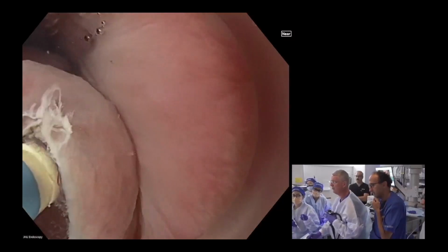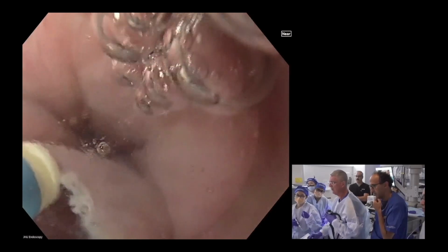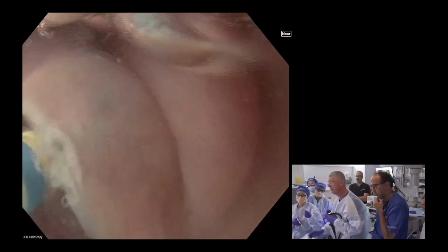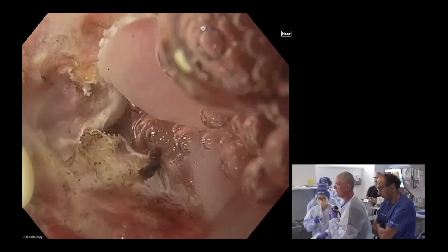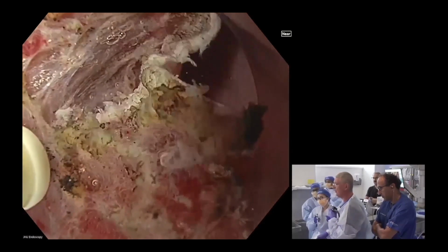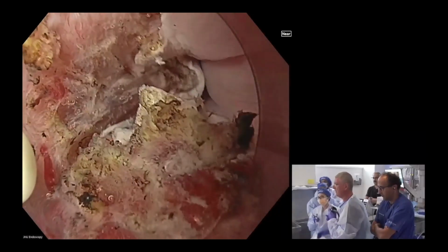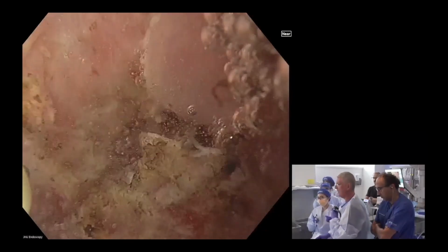You see, I use very little blue. In fact, blue is taking a lot of light off my systems. But what I did was almost a circumferential incision, except for a small part on top. And then I use the jet from the scope.